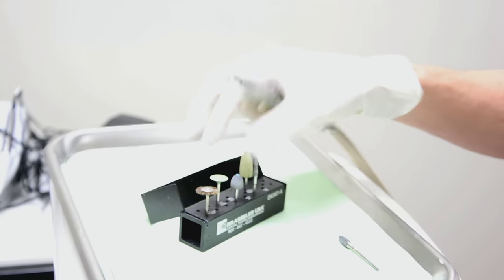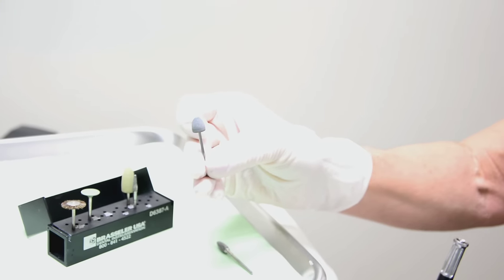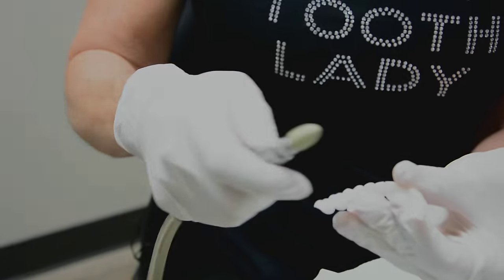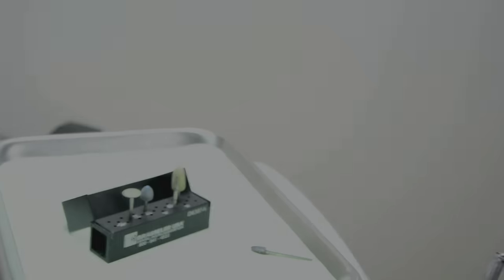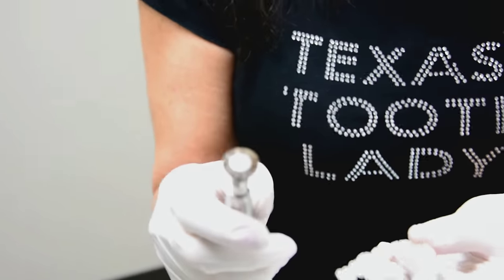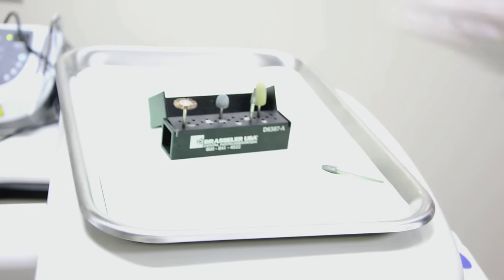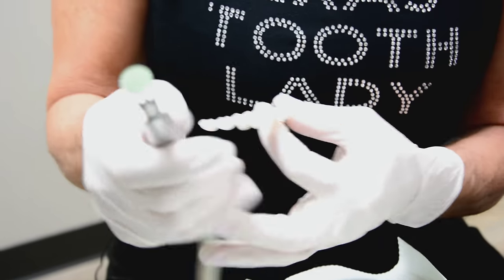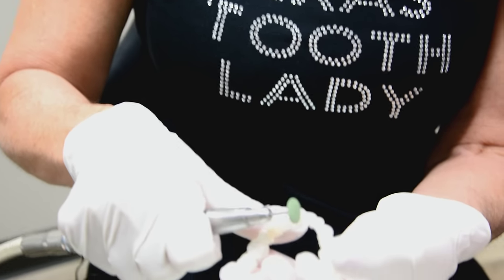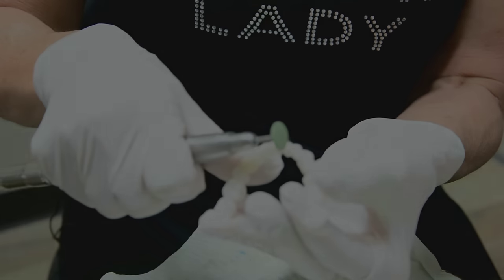After we adjust, we want to polish — we can go from coarse to fine. We take the burrs and polish first with the coarser one, then go to a less coarse. Finally, we polish with what I call a bristle brush — on a bad hair day — to achieve the final luster. If you want to open up the embrasures, you can use a green burl wheel to open them up between each of the teeth.